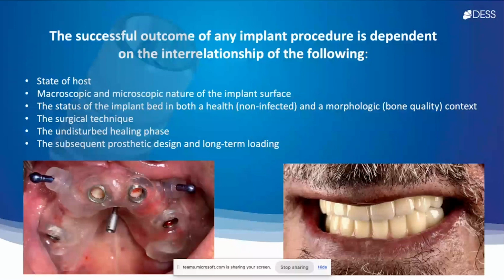Why is guided surgery very important? Because when we think of the implant, it's not just an implant in the bone. Actually, it is the prosthetic, where our final prosthesis should be. So when you are planning from the beginning, you place your prosthetic part first, and then you place your implants. So you're going to find the optimum results. That's why you have to work digitally.